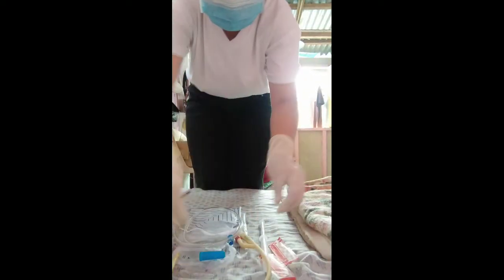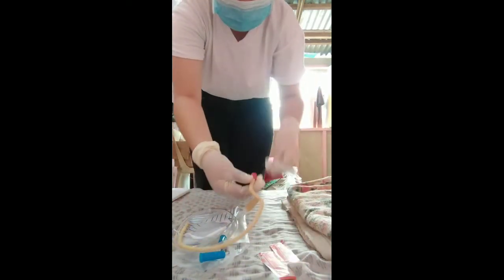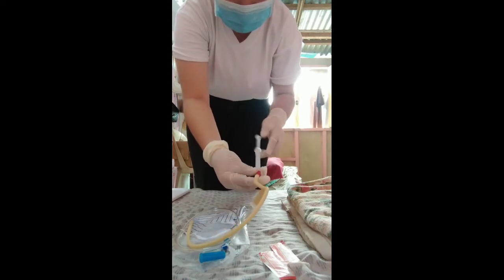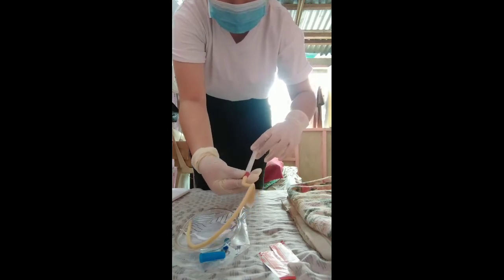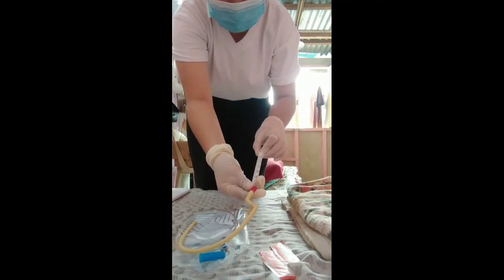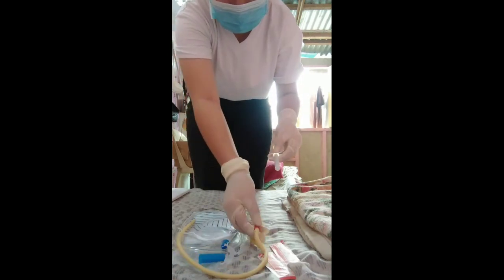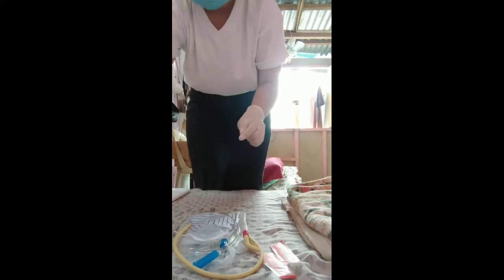So we need to put this in here. So do not inflate. Remember, do not inflate the balloon. Here, I have inserted the water into the port of the catheter, and so we need to pull back the syringe. And perfect. So put away the syringe.